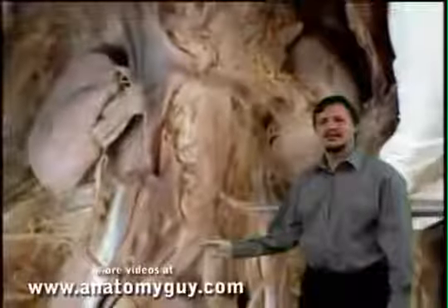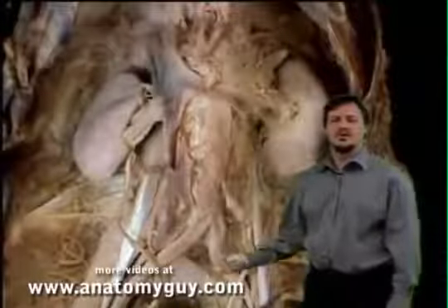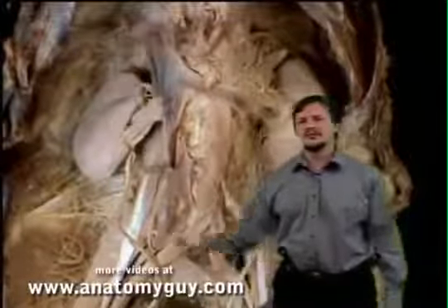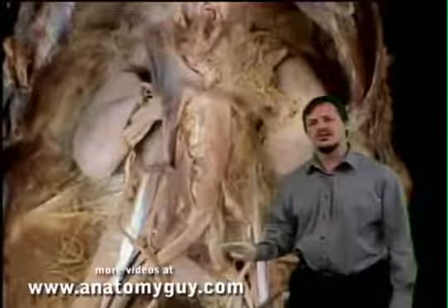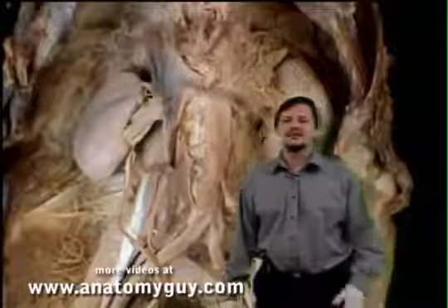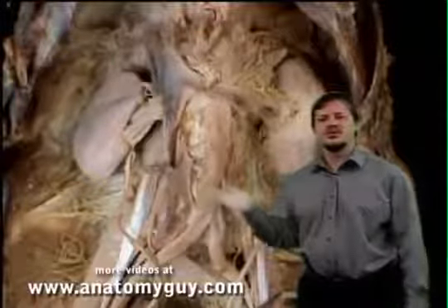Now we can see the bifurcation point, which is right at the level of L4, and that's about the iliac crest level on external palpation. The IVC is just forming underneath of those common iliacs as they come off, and that's going to be at the level of L5.